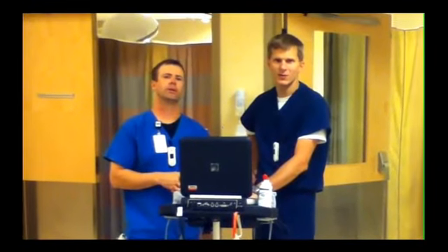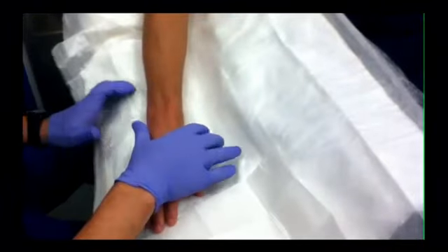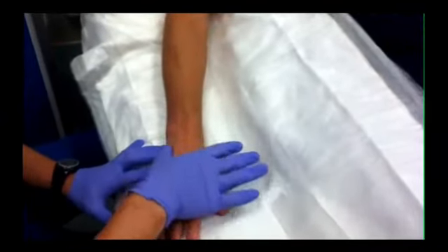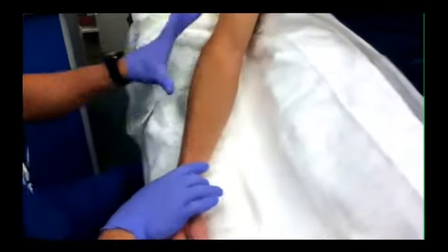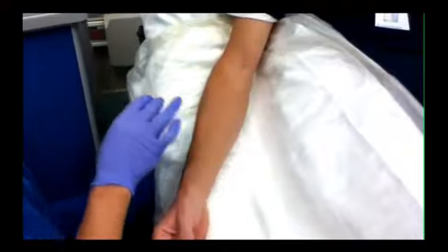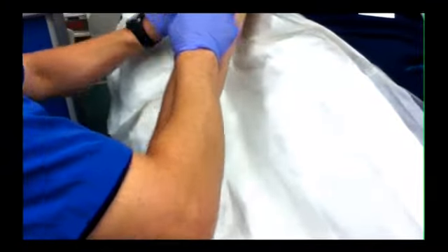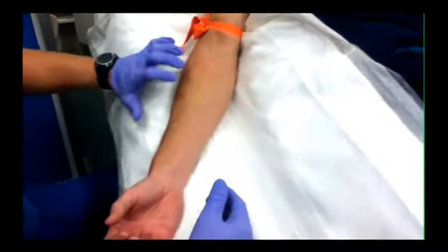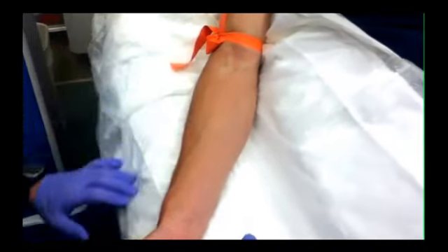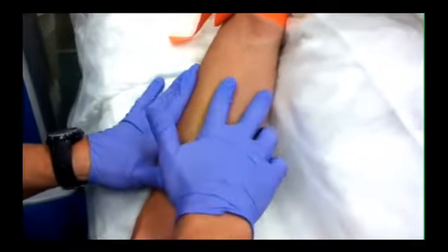A guide for everyone. So this is a peripheral IV, and what I like to do is find the best spot. For me, the back of the hand is usually the last of the options — they tend to be a little bit thinner with tendons in the way. I prefer the forearm if at all possible, or the AC if we know we're going to need a CAT scan. I'm putting the tourniquet on first, then allowing a moment or two for the veins to puff up and present themselves. Mid-forearms are usually very nice because they tend to be the most straight. For this particular patient, I'm going to use this vein right here — it's nice and straight and has good puffiness to it.